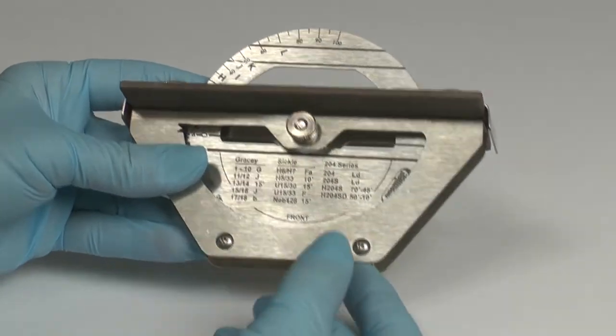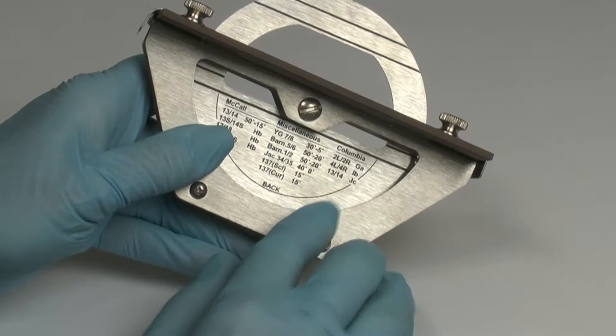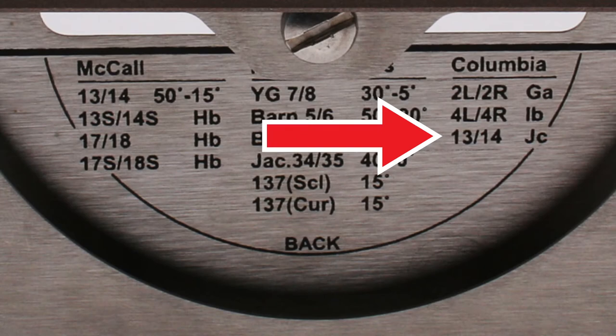When sharpening a universal curette, there are two settings corresponding to each adjacent cutting edge on the same working end. For the Columbia 1314, the disc settings are upper case letter J and lower case C.